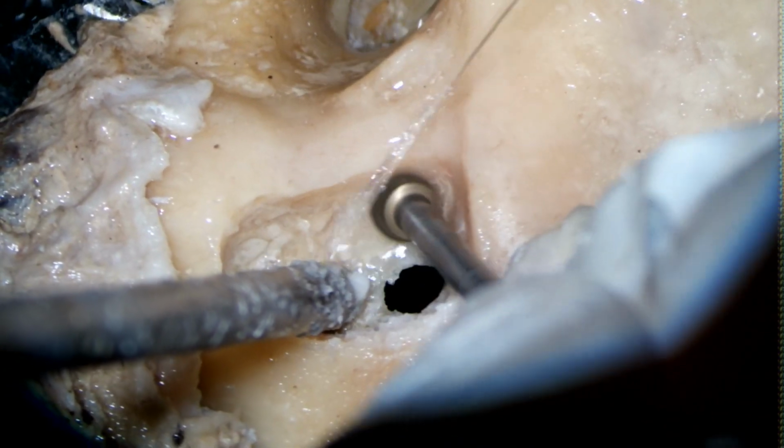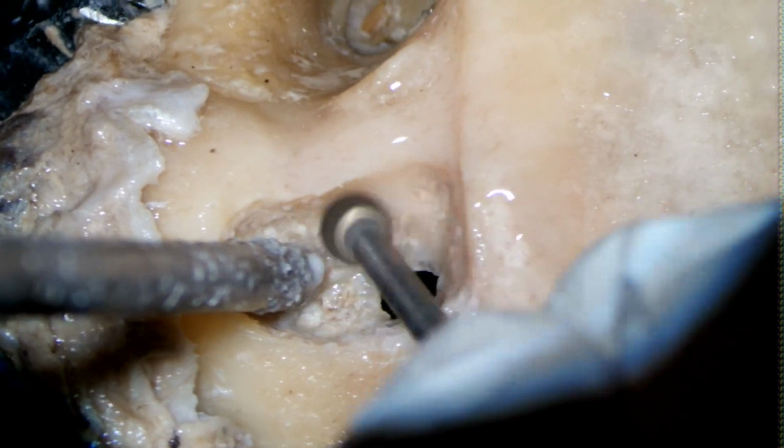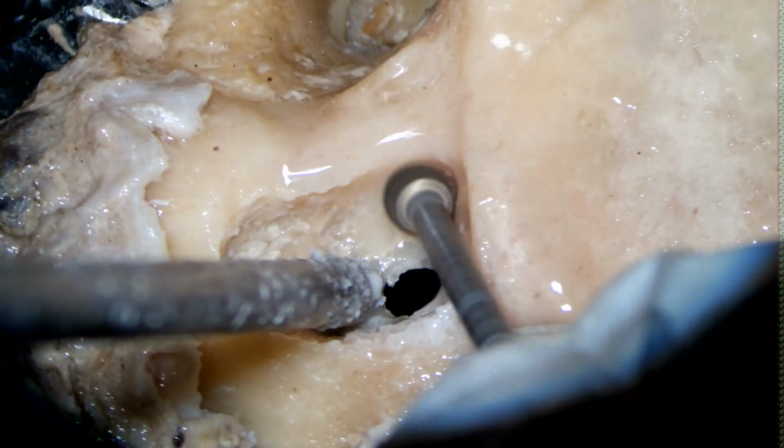Okay, so I'm trying to find the antrum here, and it is supposed to be very contracted mastoid bone.